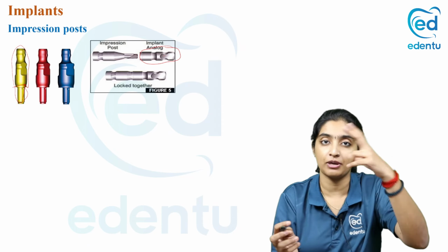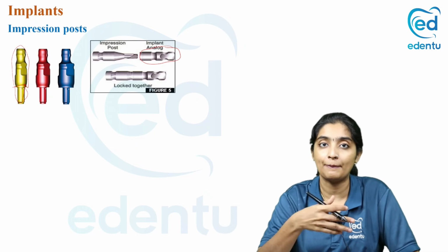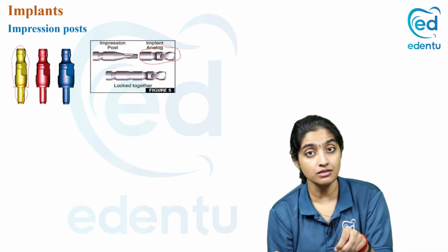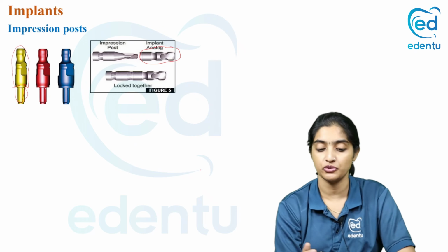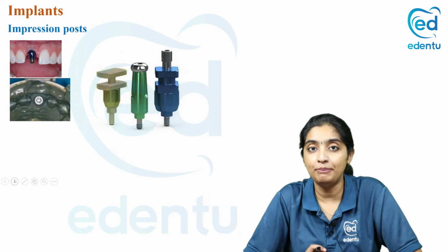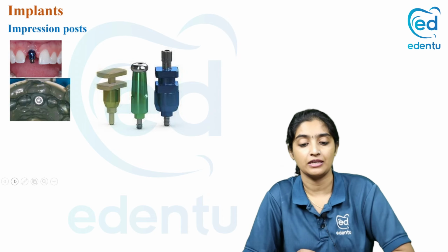So once the impression is taken out, you attach your implant analog to the impression post and then pour the cast. Apply separating medium and then pour the cast. When you take out the cast, your implant analog is inside the cast and your impression post is outside, and you remove the impression post. So basically, you are trying to replicate your patient situation in the cast, in the same way where your implant is inside and you are going to place on top of that.